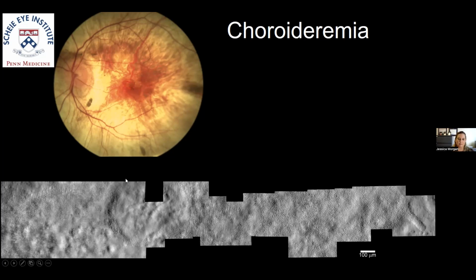You have this kind of loop that shows up in their area of retained retina, that's this encroaching border right here that dips down within our mosaic. But then the retained island is back. It has this moon shape for this person. And you can see the photoreceptor mosaic again as you move out across that temporal parafoveal region.